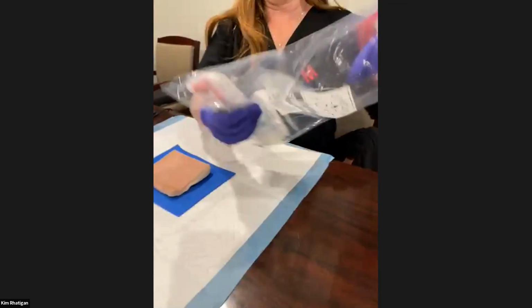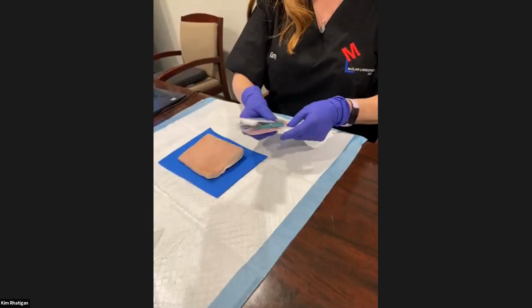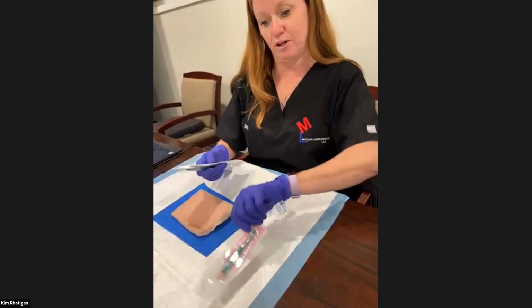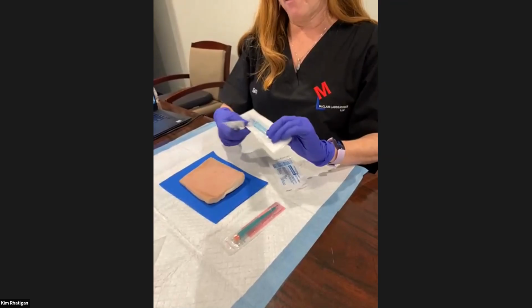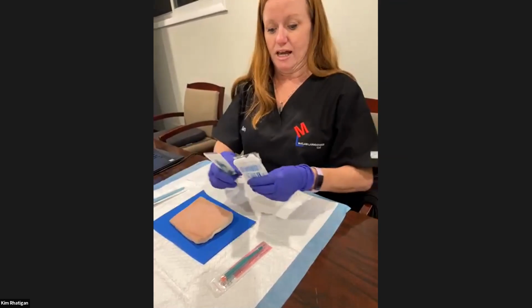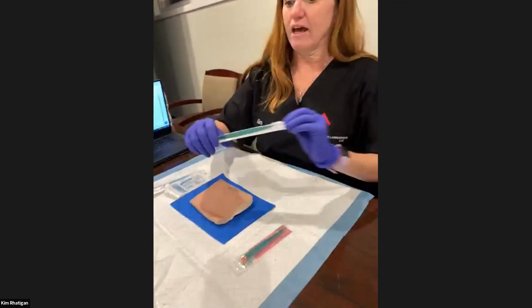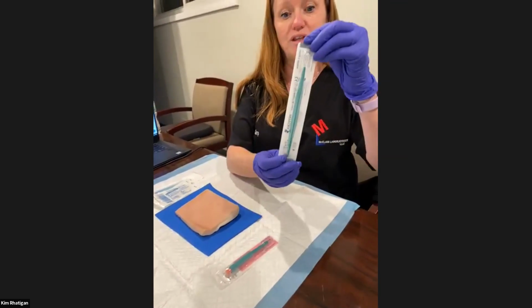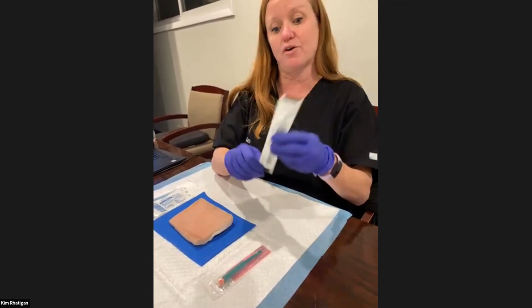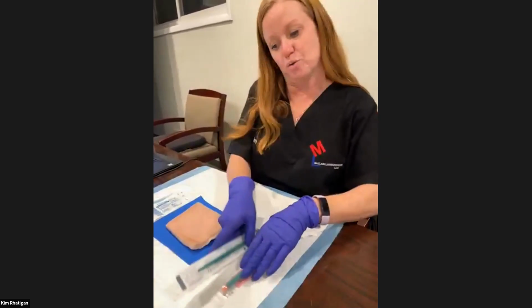Okay, and then I'm going to take my tools out of the bag. I have 4 tools. I have the punch biopsy with the plunger. This is a 3 millimeter. I have my shave tools: a regular number 15 scalpel, and a dermablade for the shave biopsy. And last but not least, our favorite tool, the curette. This is a 5 millimeter curette. These also come in different sizes. If you have these at the clinic, they have them in all different sizes. Same with all of these tools.